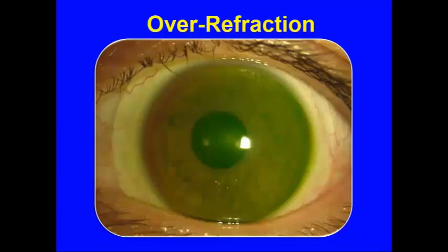Once that lens has been placed onto the eye, we've evaluated all of the 4 zones of the contact lens, and over-refraction can be performed. Now, as in fitting any rigid contact lens, the bulk of the underlying astigmatism is going to be corrected by the tear lens beneath the contact lens. However, if some residual astigmatism is present, a spherocylinder over-refraction can be performed, and the Ampleye design is available in a very effective anterior toric lens design.